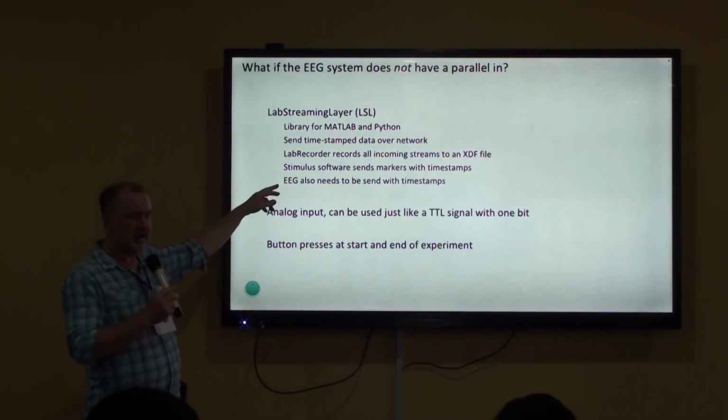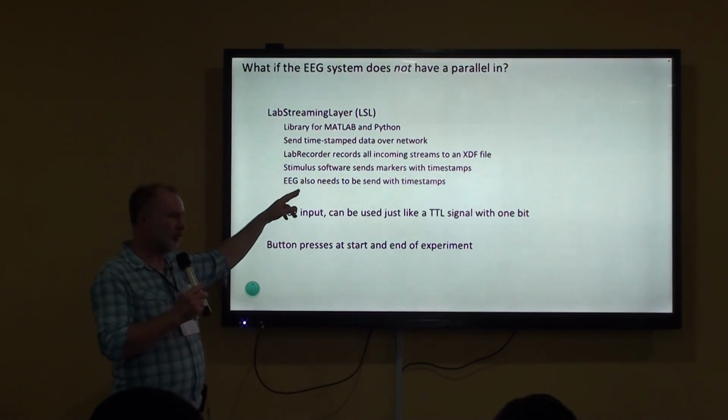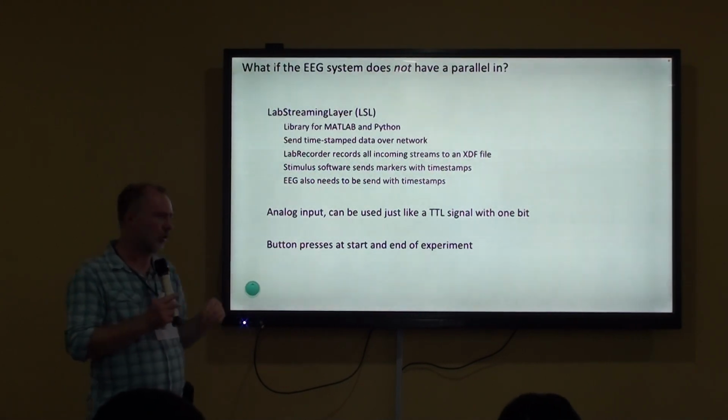So that also means that if you use lab streaming layer to send the markers, you also need to use lab streaming layer to record the EEG, because they need to be sent with the same timestamps relative to the same network clock.